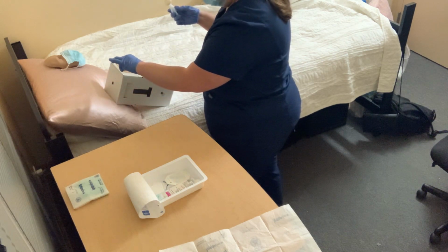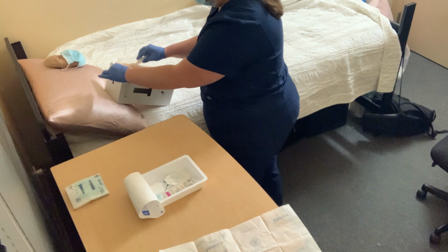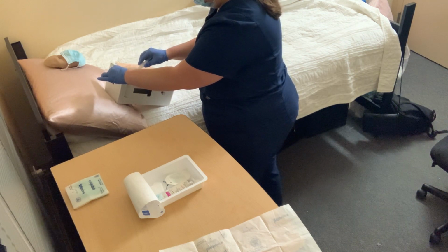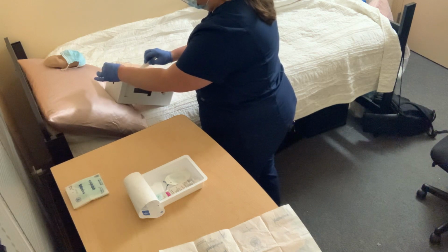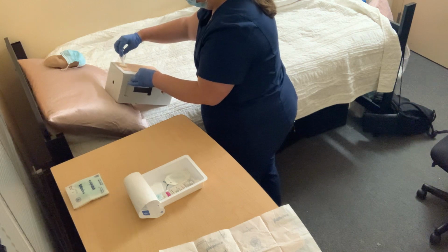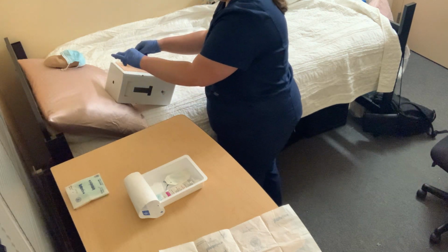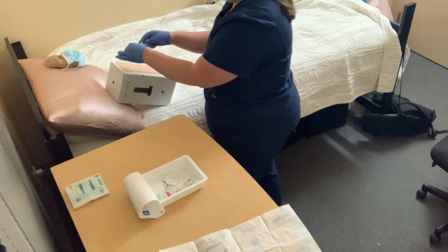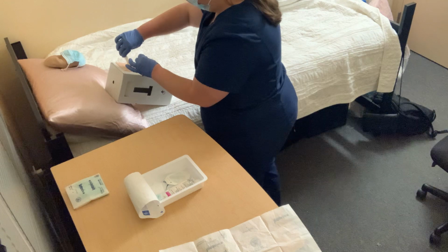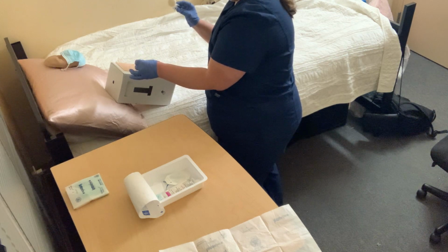So my left hand is going to be used to hold the tubing, and my right hand is going to remain sterile and clean. I'm going to clean a 2-inch border around the insertion site. All right, so now that I've cleaned a 2-inch border around the site, I'm going to clean the tubing itself, going all the way up on all 4 sides. And now I'm going to let the tubing dry as well as the skin for 30 seconds.